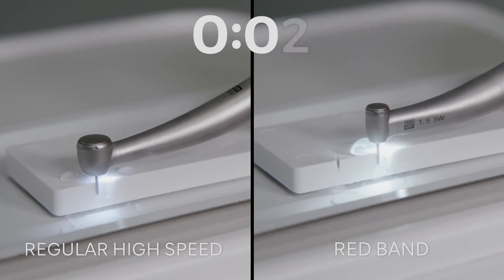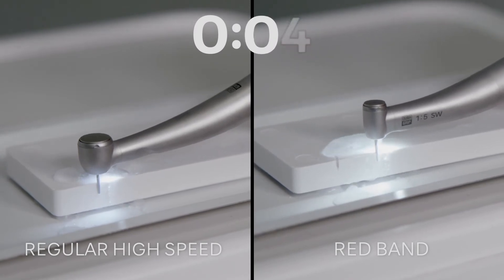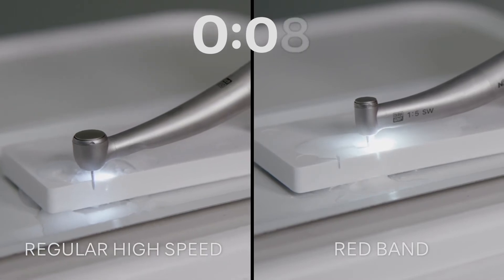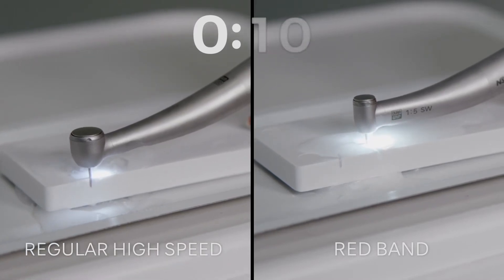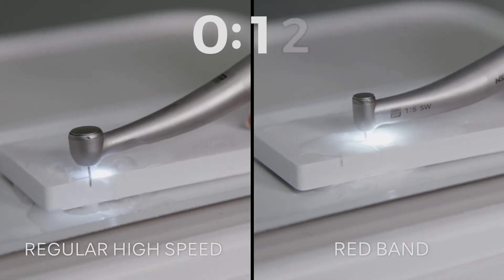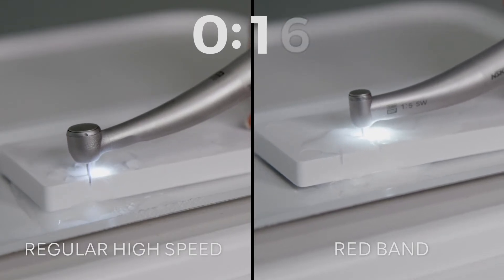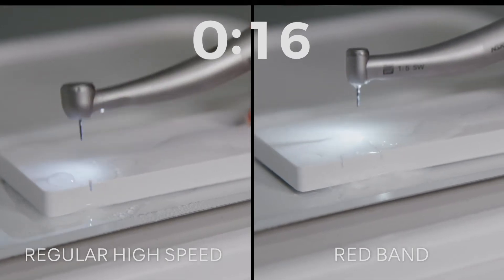This allows you to use the red band to perform a range of procedures, including preparing, removing and finishing restorations, cutting through gold, ceramic and zirconium materials, cutting and preparing tooth structure for restorative, endodontic or surgical procedures, and many more.